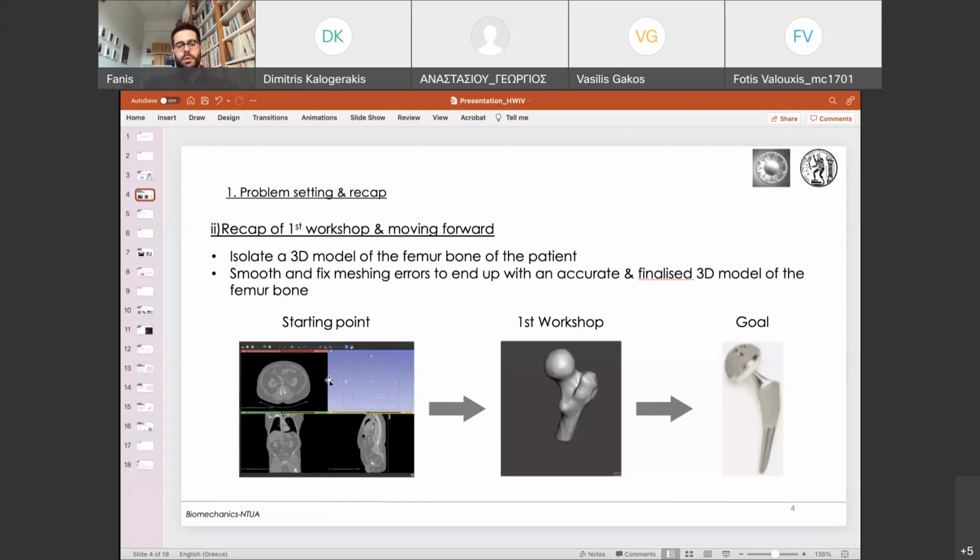Then we used another program to fix some meshing issues or imperfections that may be present in the model and make it smoother as it should be. So that's how we ended up with a pretty accurate 3D model of the patient's femur bone. For this workshop, our goal is to design a very basic femur implant that could be used as a replacement to the top of the femur bone of the patient.